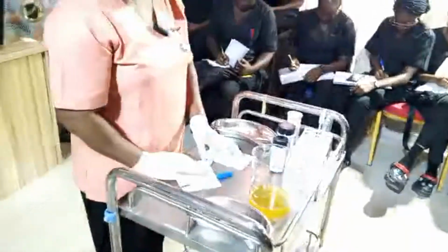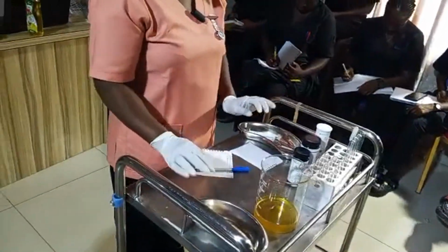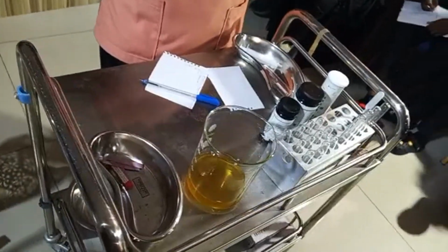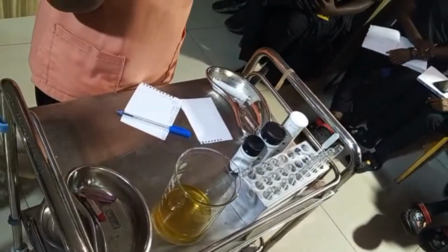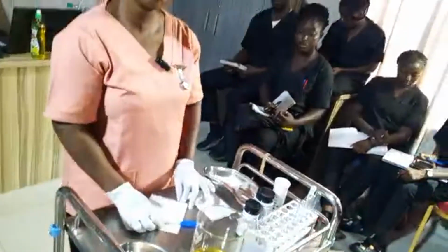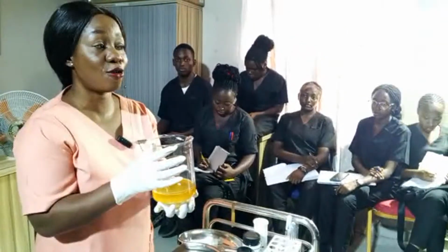Order, sorry, and reaction now. I will do reaction and specific gravity last because I don't want to contaminate my pen, right? And then what is C? What did I say, C? So let's look at the color. What's the color of this urine? It's amber in color, right?